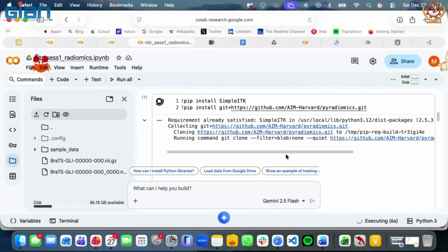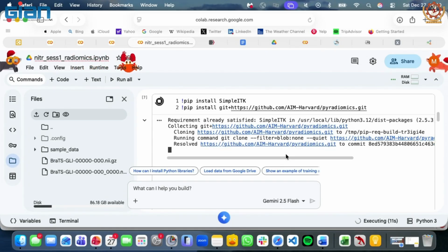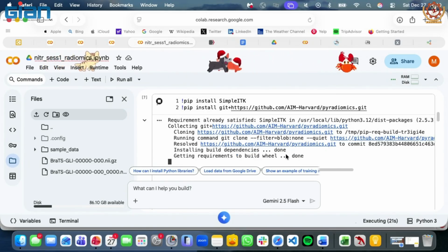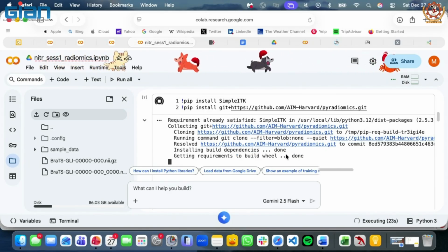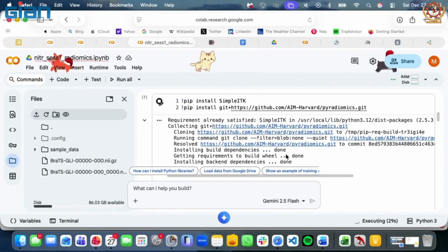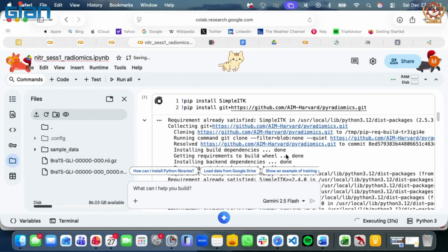By the way, these are not the only set of radiomic features that people use. You can use these features for a start, but if you are developing a machine learning model based on your data, or if the problem statement is different, you can think about your own radiomic features, what other features you can calculate from whatever segmentation masks you have that will make a better prediction.